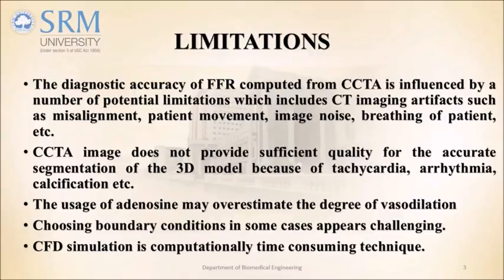CCTA images may not provide sufficient quality for accurate segmentation of the 3D model because of tachycardia, arrhythmia, calcification, etc. The usage of adenosine may overestimate the degree of vasodilation. Choosing boundary conditions in some cases appears challenging. CFD simulation is a computationally time-consuming technique.